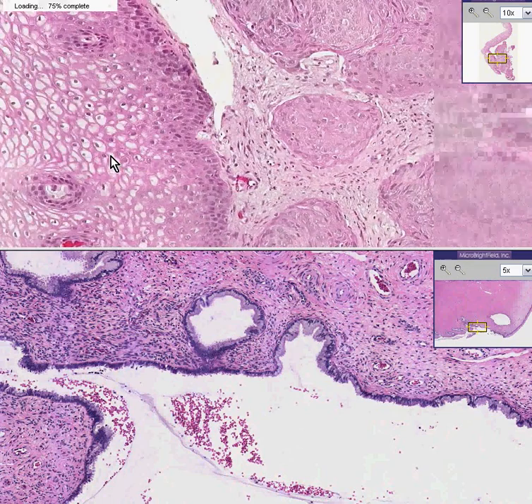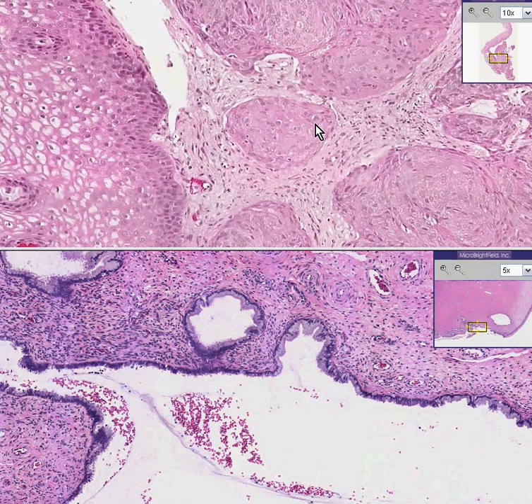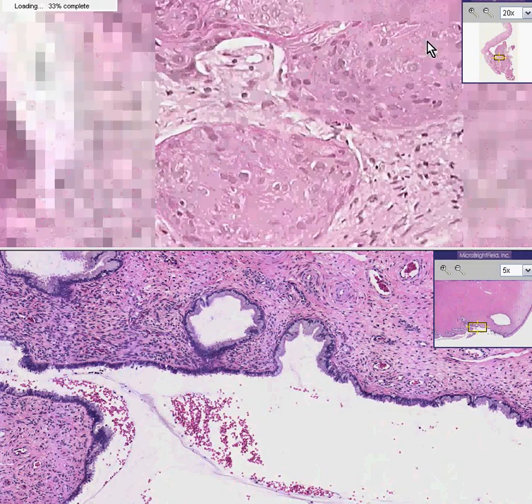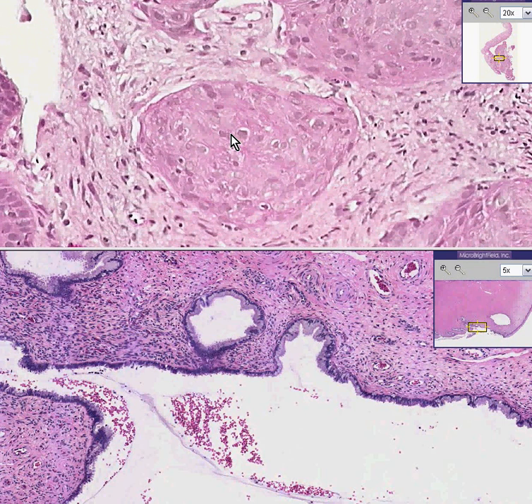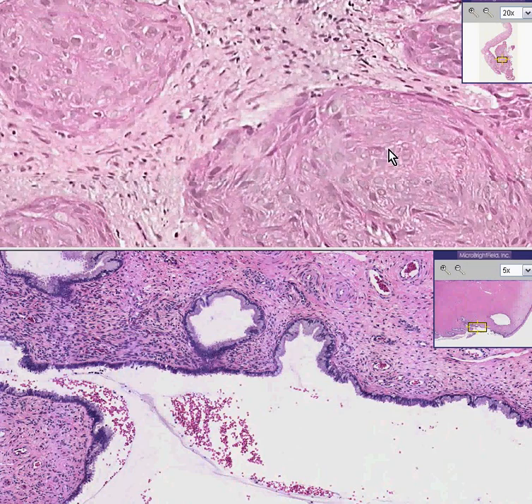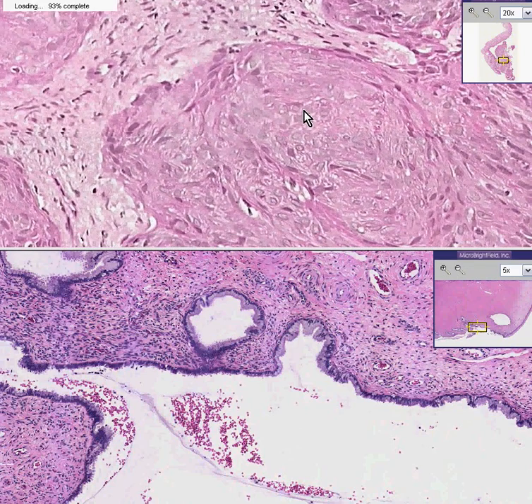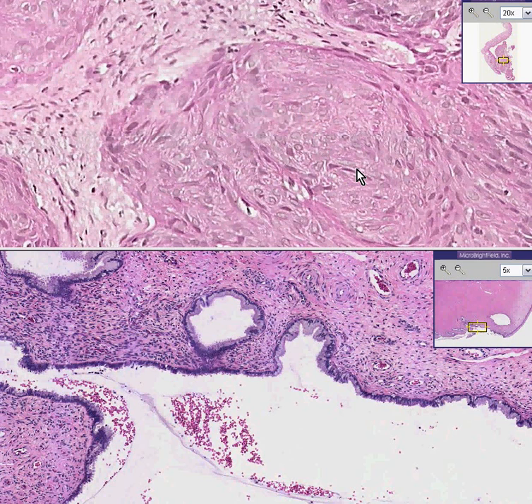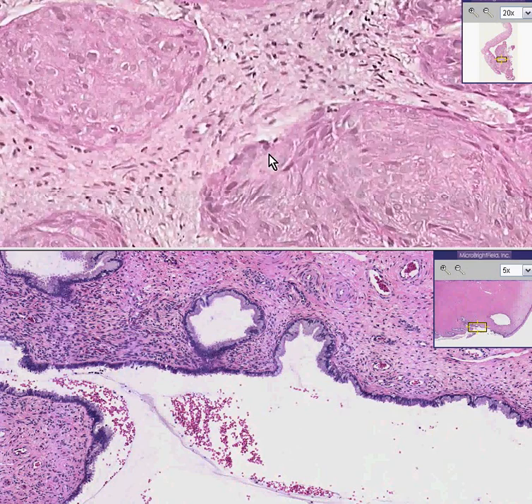Notice, however, that within the stroma you have nests of cells completely surrounded by stroma. This is infiltrating squamous cell carcinoma. Notice that it looks squamous. If you look higher, you could see that these are absolutely squamous cells because in these little slit-like spaces — here and here and here — you can see these little ladders or intracellular bridges. So you know these are squamous cells.